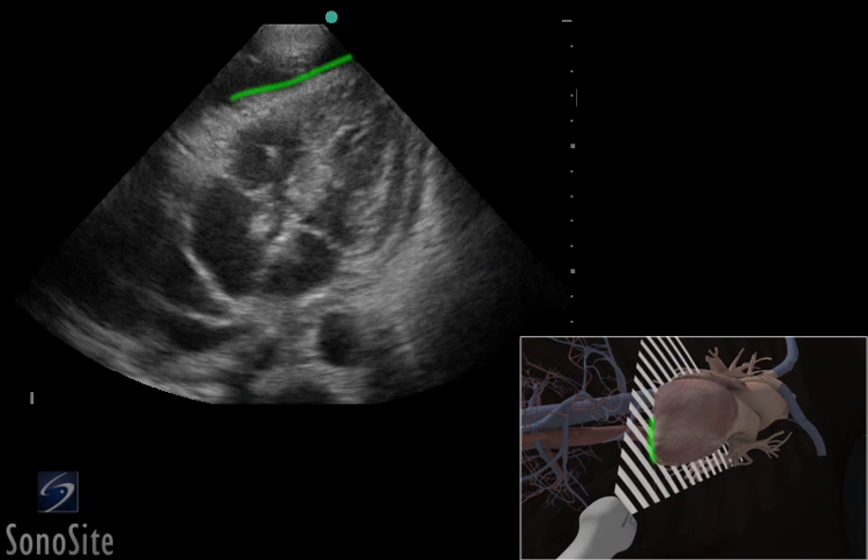The apex of the heart is visualized closest to the transducer. Move between the apical and parasternal long axis views of the heart to determine the most superficial and largest pocket of fluid.